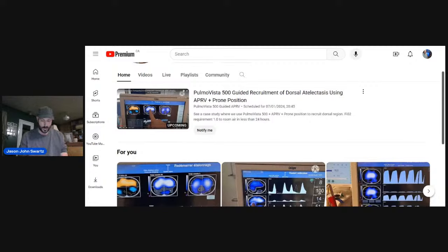It's always a good idea to be watching on another screen because sometimes something might not be functioning well.